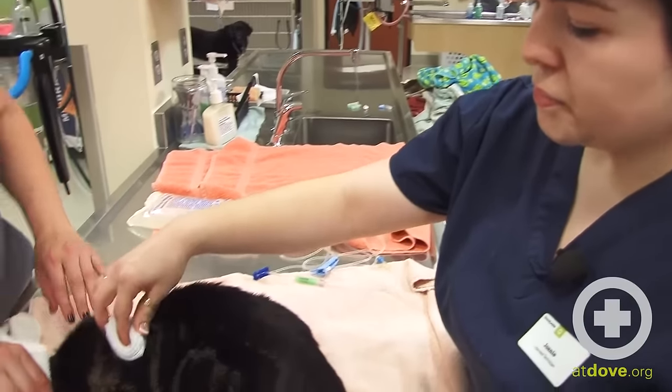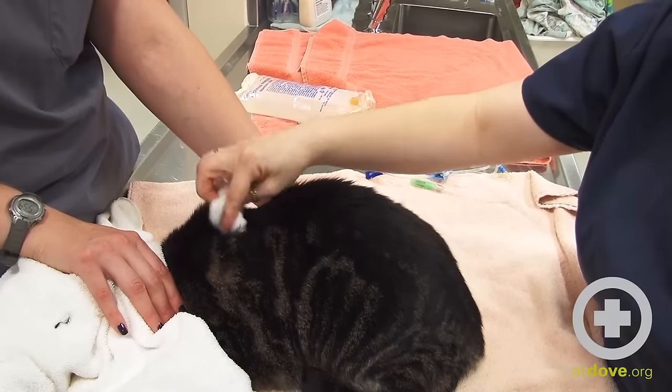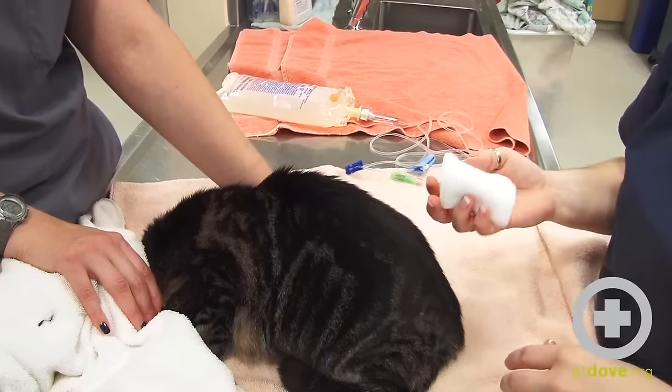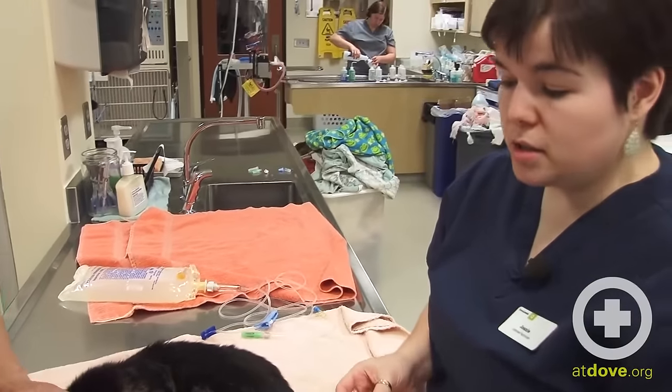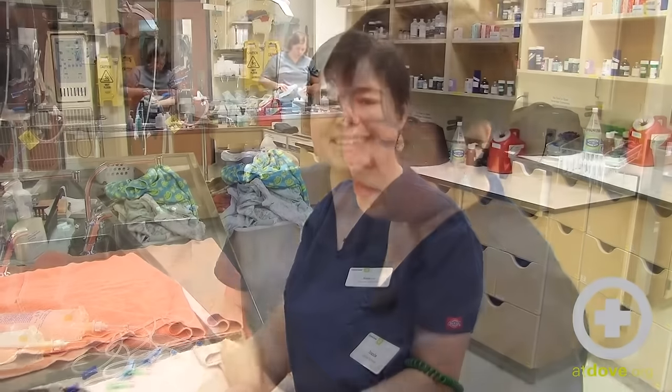Now where I gave the sub-Q fluids, we've been holding a little bit of pressure with some gauze, and you can see that she's no longer leaking fluid. If she were to leak fluid out of there it could be a little blood-tinged — that is completely normal — but you just want to make sure as much of it stays inside as possible. And that is how we administer sub-Q fluids in a cat.